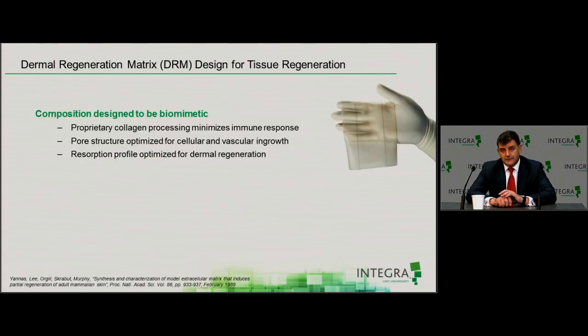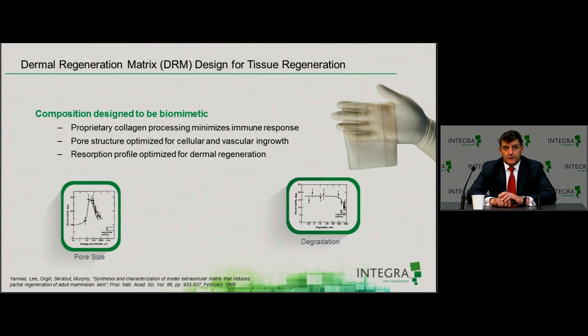The composite design is really in the category of a biomimetic design. In other words, it was something that was engineered to try to mimic the way our body works. And this was really thought up by a burn surgeon and a basic scientist who were trying to come up with a way of treating chronic burns by having something that could act like skin as a moisture and vapor barrier and then allow for healthy generation of dermis on patients who are massively burned. So this unique pore size that was designed and engineered probably does have an optimal structure. That's not well defined in the literature at the moment, but in general this allows for cells to come directly into the dermal regenerative template immediately after debridement or application and fill that template and then go on to generate a neodermis that we can go on and epithelialize, or in smaller wounds, as you will see, epithelializes by itself.